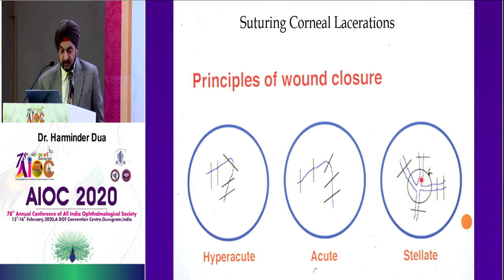And inside here, you can pass a running stitch through the stroma all the way and bring it out of the wound, tighten it, and then you can roll it away from the wound. And usually this one is completely buried and you don't take it out. If it is still leaking, then this thing here is to remind me to tell you that you take a bit of cyanoacrylate glue or a fibrin glue. And again, Dr. Syed will tell you much more about that.